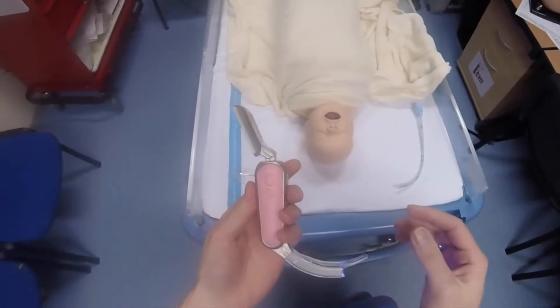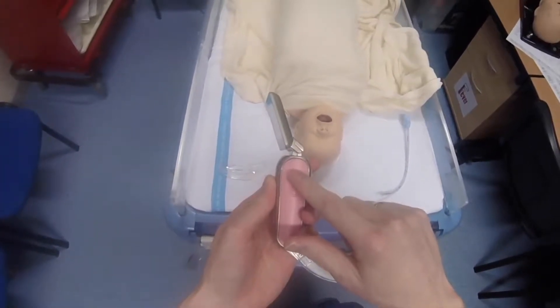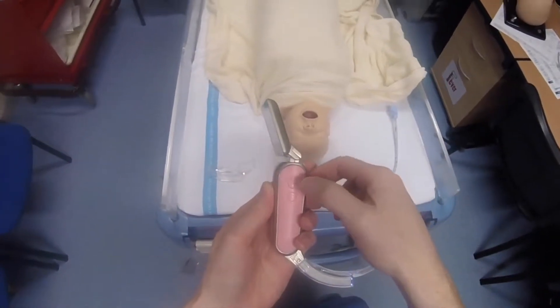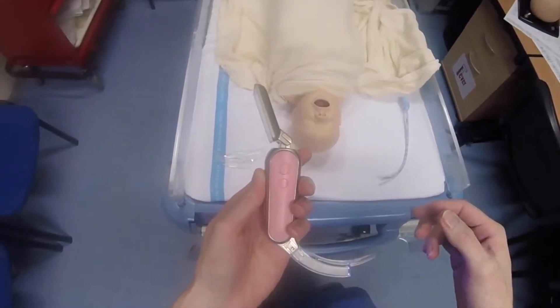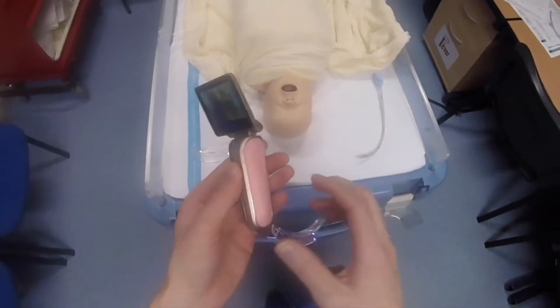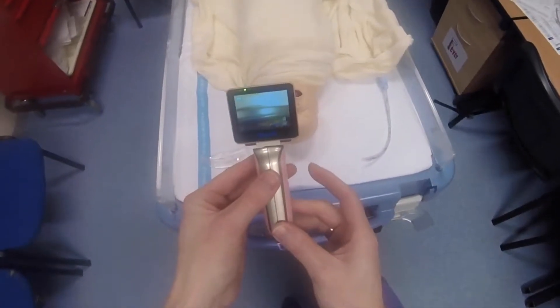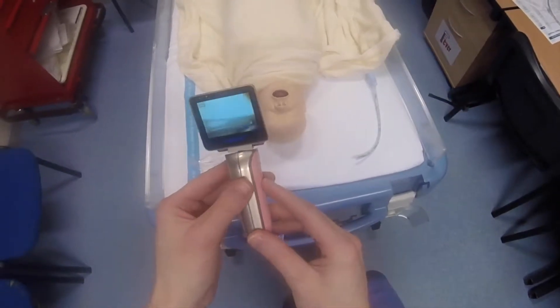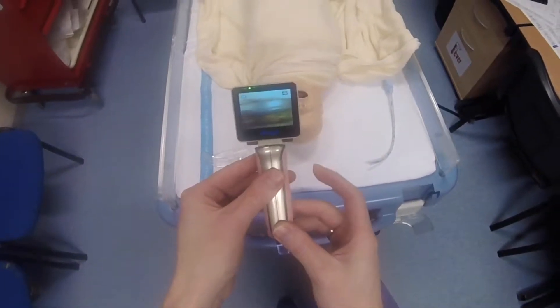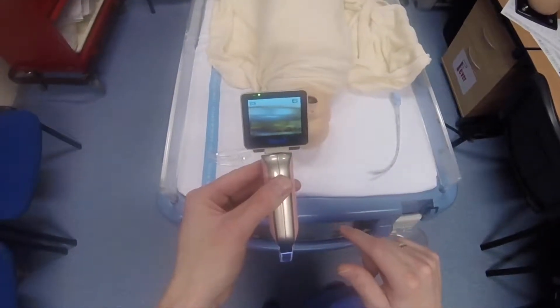The laryngoscope really only has two buttons. There's the power button — a long hold when it's off to turn it on, and a double click to turn it off. Below that is a photo and video recording button: a single press takes a photo, and a long hold starts video recording, at which point the video icon appears along with a timer at the bottom.